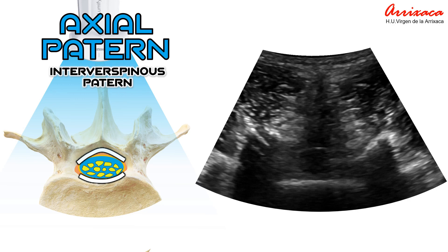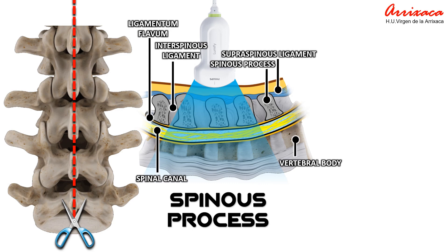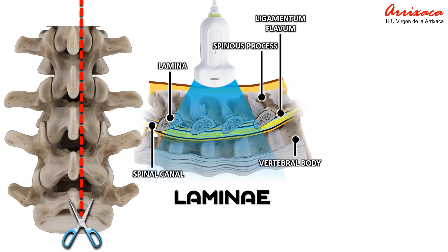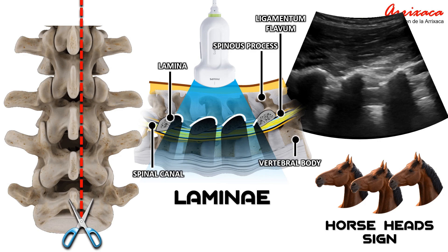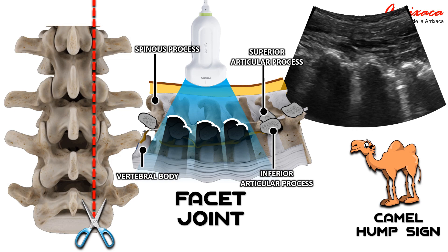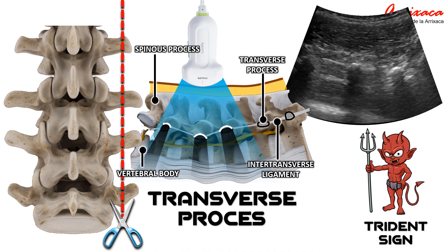In the sagittal axis view, starting over in patients with normal body mass, we will not be able to identify any structure. The acoustic shadow of the spinous processes — the mountain sign — will only be visible in patients with large adipose tissue in the lumbar region. Sliding the transducer laterally, the laminae will become evident. We will observe discontinuous shadows with acoustic gaps between them, known as the horse head sign. Through this discontinuous acoustic shadow, we will identify the spinal canal between every lamina. Over the facet joints, the acoustic shadow will change and take on a camel hump look. Over the transverse processes, three consecutive transverse processes resemble a trident, composed of highly echogenic curvilinear structures with finger-like acoustic shadowing.